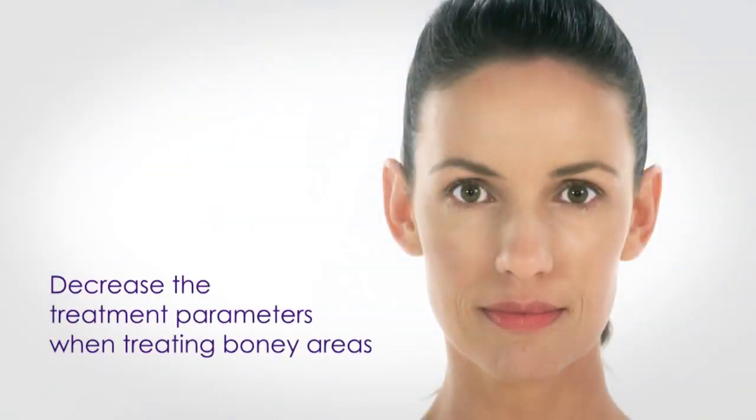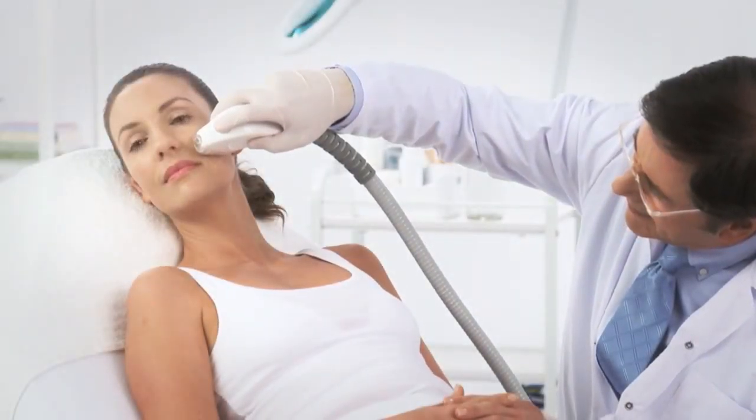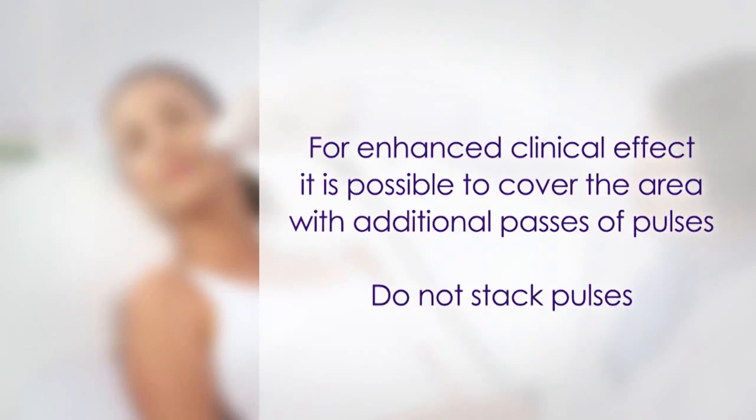Decrease the treatment parameters when treating bony areas such as the forehead, jawline, or temples. Continue this procedure for full and uniform coverage of treatment area. For enhanced clinical effect, it is possible to cover the area with additional passes of pulses. Do not stack pulses.